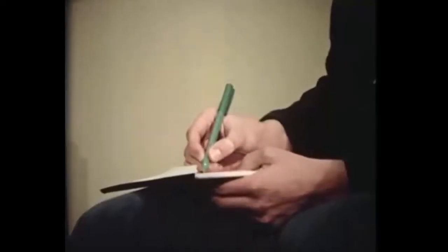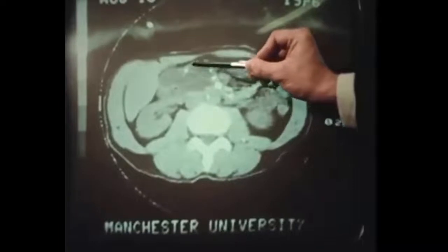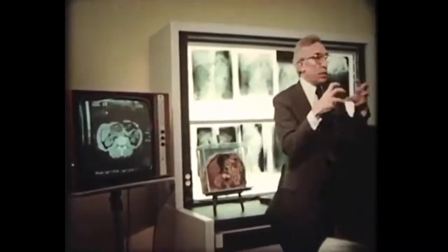What computed tomography is enabling us to see, in addition, are the two lower density areas. These are two cysts in the head of the pancreas, which are expanding the pancreas and produced by blocking of the pancreatic ducts. And it's the sort of thing we might be looking for in Mr. Chadwick.